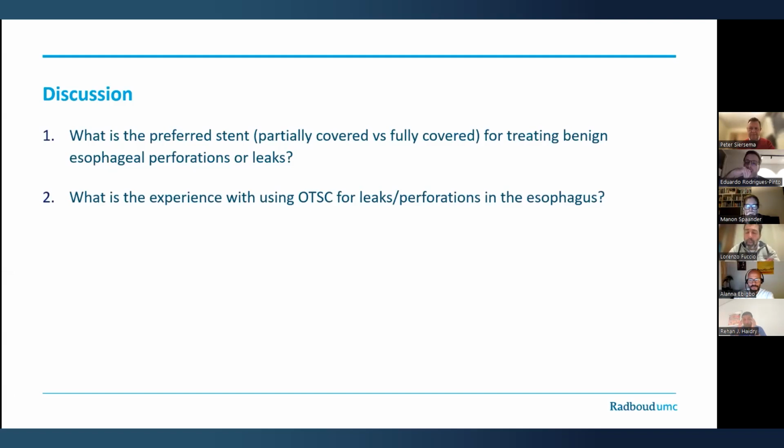Yeah, we have little experience with this device, because you have to be lucky that the perforation, the leak, is very small, and to be sure that you can grasp the margin and put all of it inside the OTSC. You have to be very careful when you release this device, because otherwise you can also create a stenosis. But yes, it's very fine.